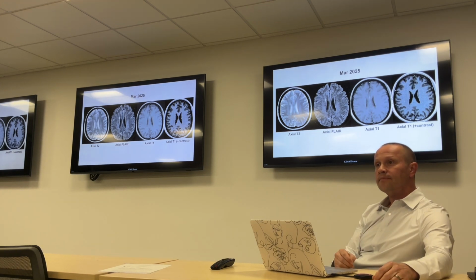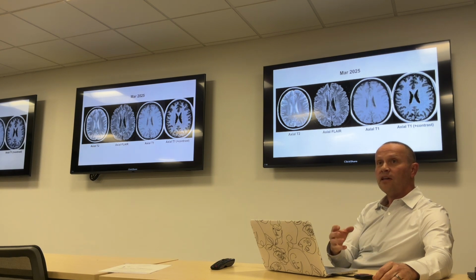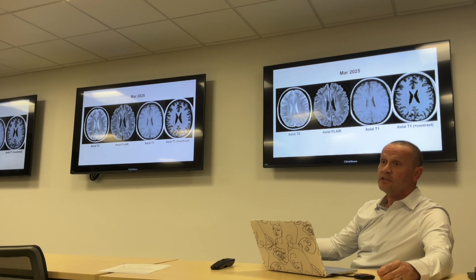So the contrast is just to see if it's active. In this setting, yes, that's basically what it is. You're looking to see if any of the plaques are active. Exactly, if they're actively demyelinating.